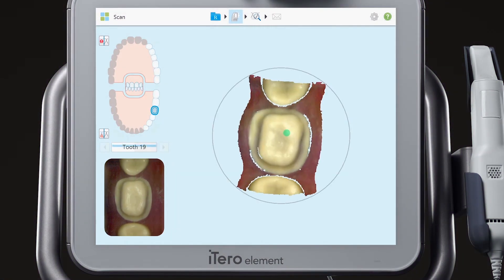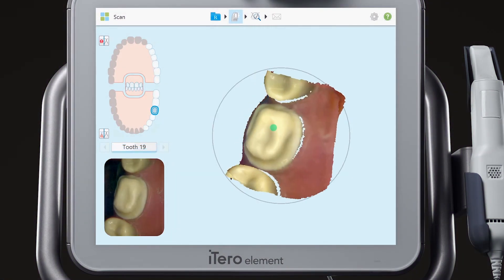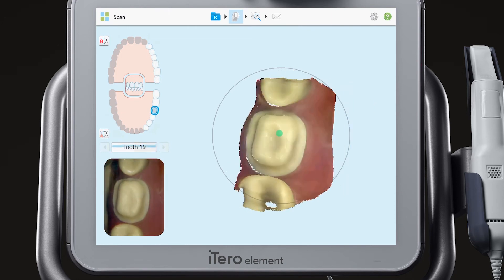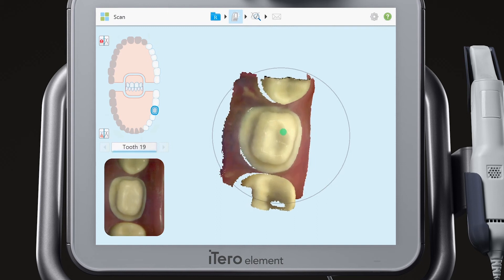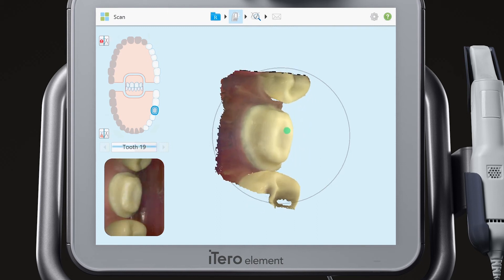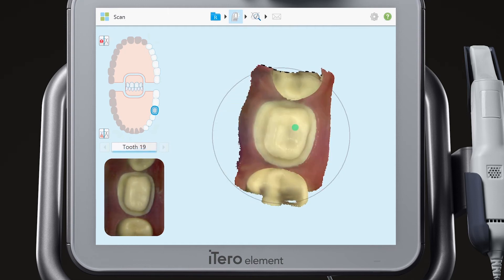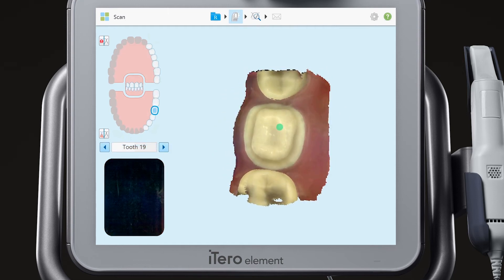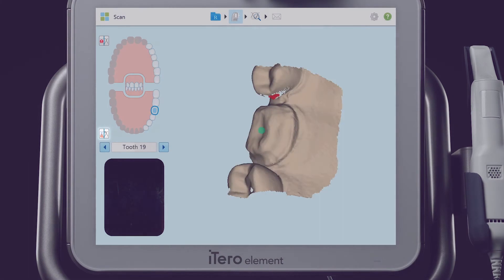Scan the occlusal, lingual, and buccal of the prepped tooth. If the green dot is not on the prepped tooth, move it to the prepped tooth. Viewing the scan without color will highlight additional detail.